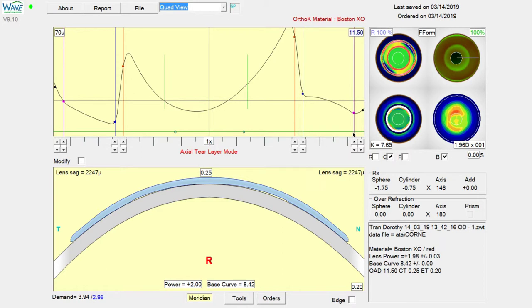The unusual topography I mentioned in the email was this here. You can see there's almost a ring of mid peripheral steepening, as if this patient was already in ortho-K or had LASIK in the past, which is a little bit unusual. That's not how the cornea normally is.